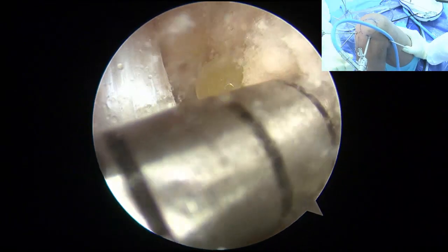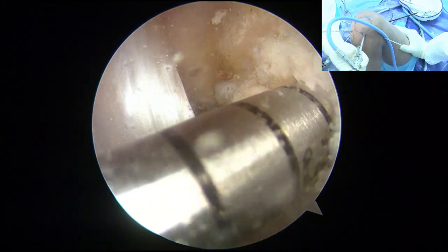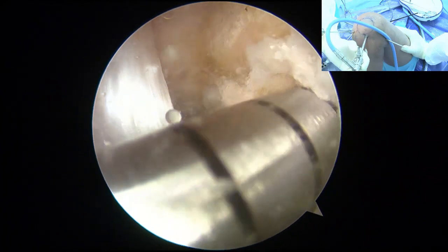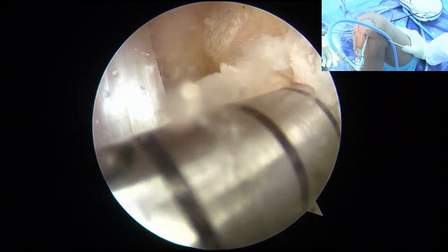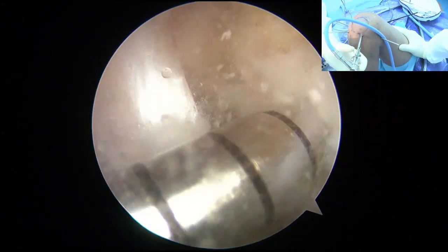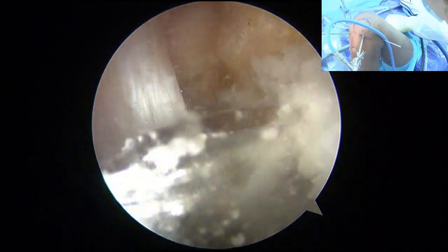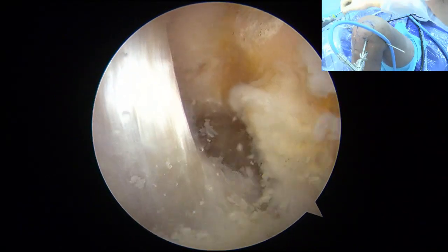Okay, here at the same time suction is on. At the same time, you look at the measuring. How deep is that now? 30 now, right? 30. You can feel the hard cortex now. I think it should be 35, yeah, maybe. 35左右。Then we use a depth gauge, okay? But this is lucky, because sometimes we get a very short tunnel, because nowadays we put the ACL lower, so the tunnel is always shorter.